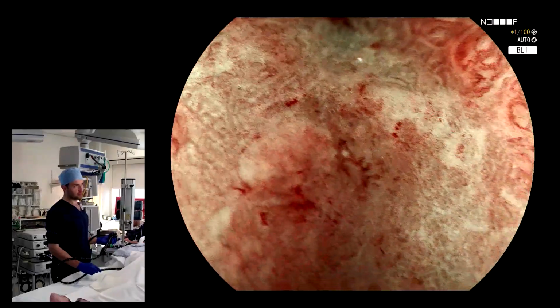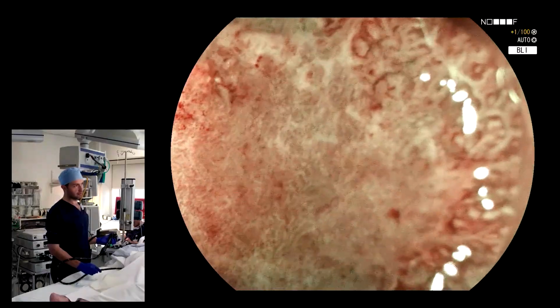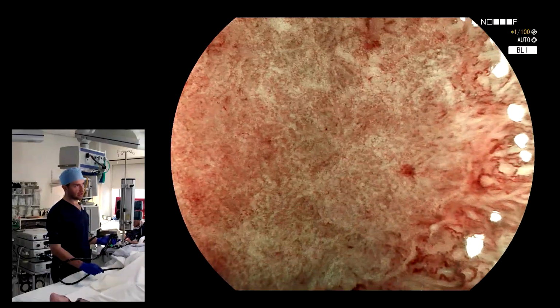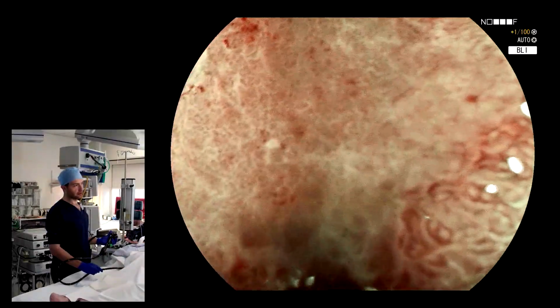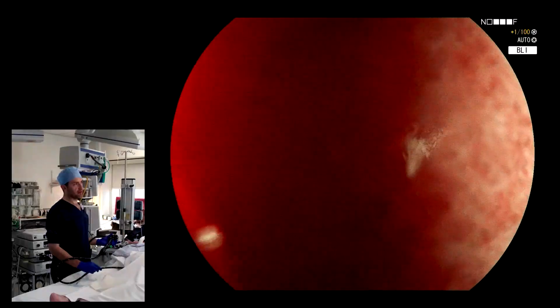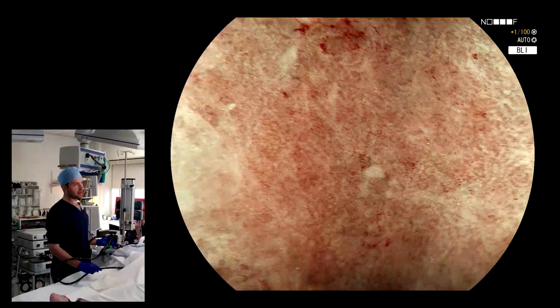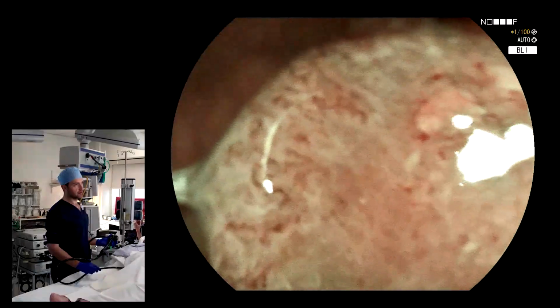And so this is all right. I can actually do this quite nicely here using the cap. But if you want to do it better, that natural magnification effect and the floating effect of water or saline really helps with this. And you really want to try not to traumatize it. So you can see that as it comes towards me, I lose the beautiful image. It's moving around a little bit.